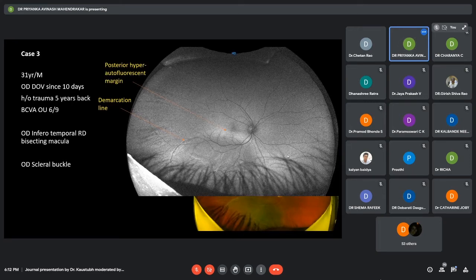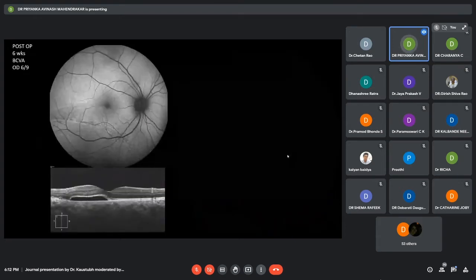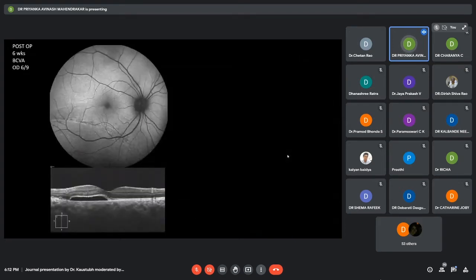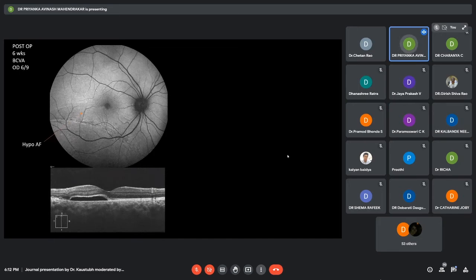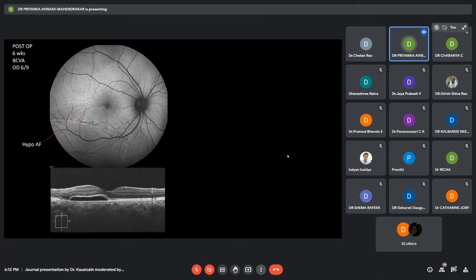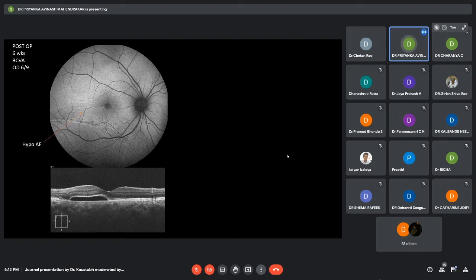This patient underwent scleral buckle surgery. Autofluorescence imaging was done postoperatively at 6 weeks. His visual acuity was 6/9. Here we can see a hypo-autofluorescent patch below the macula, which correlated on the OCT as SRF subretinal fluid, again lined by elongated photoreceptor cells.